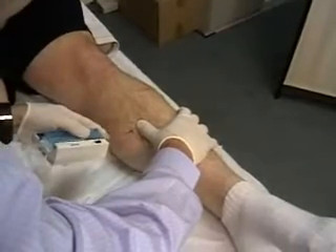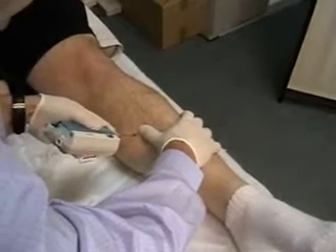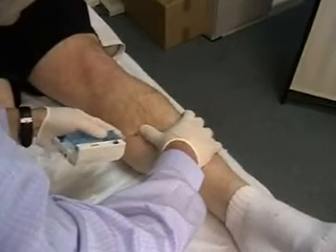We're testing for the deep posterior compartment here, so it's in along the undersurface of the medial tibial border. What we feel for is the first pop of the superficial fascial sheath, which we've gone through there.